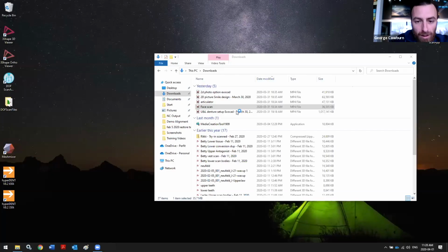Okay. And so, yeah, that is the easiest way that we can avoid problems. And that is really the greatest benefit of digital design: number one, being able to do multiple arrangements without really taking hours and hours, as well as being able to make changes on the fly.